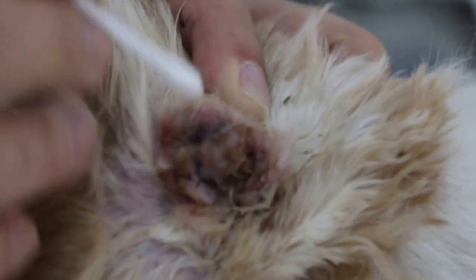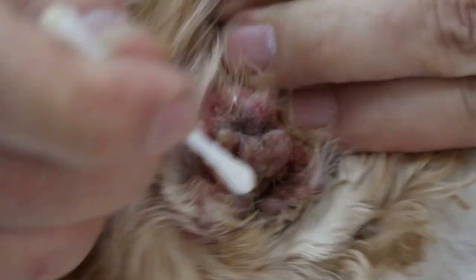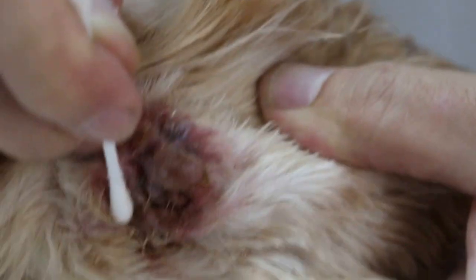Yesterday I gave anti-inflammatory antibiotics, so the vertical canal has opened up slightly, not all the way. As you can see, this is the opening of the vertical canal.